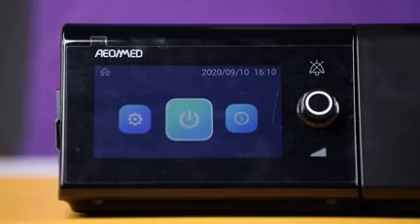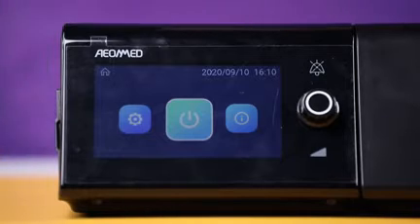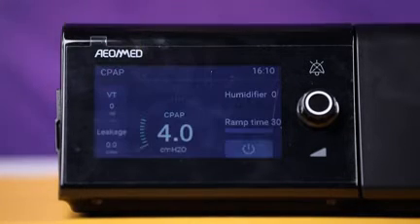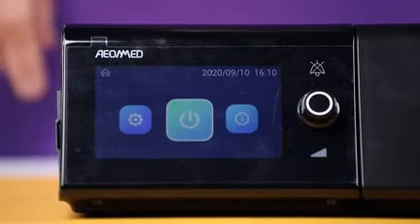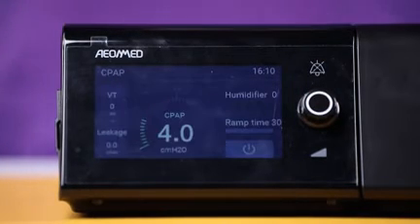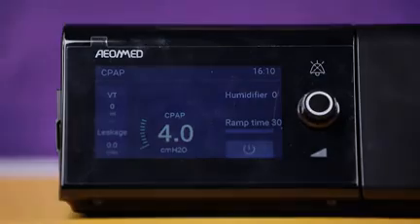There are 3 ways to start ventilation. You may either click the start button on the touchscreen device, or click on the navigator knob. The third alternative is to set the device to auto on. Put on your mask and breathe 3 times. The device will automatically start to work.